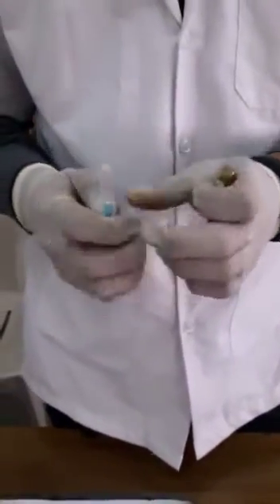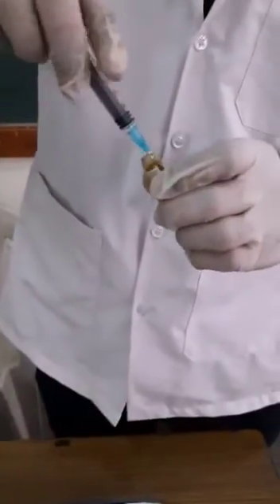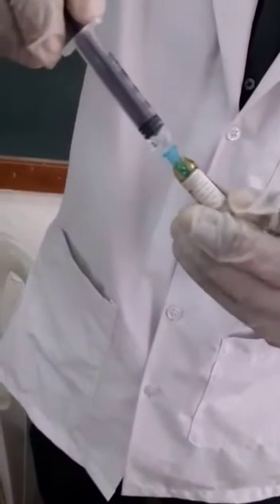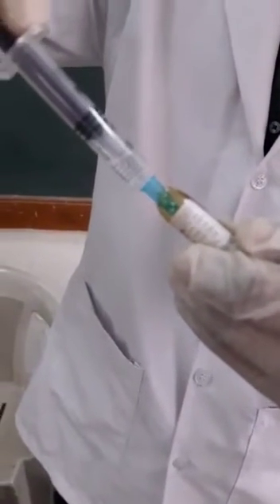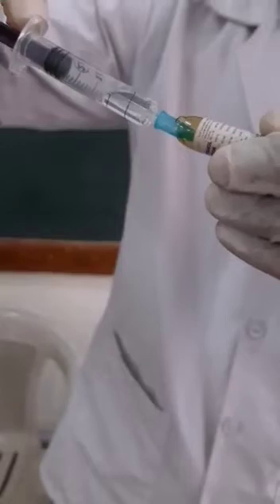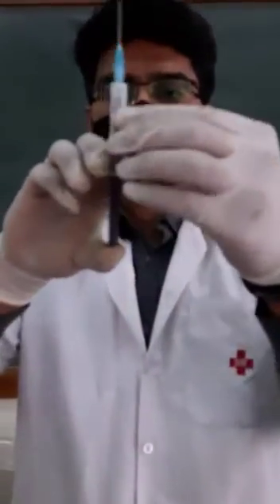Aspirate the fluid from the ampoule. Carefully dispose of the ampoule. Make sure to remove any air bubbles from the syringe.